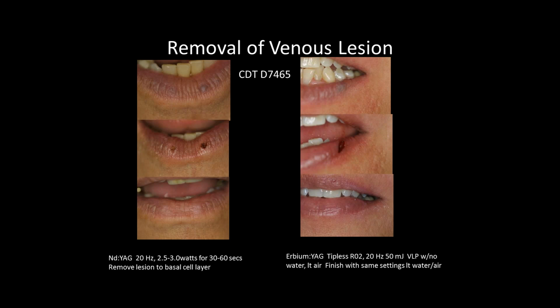Even the case on the left is actually a gentleman that just brought it to our attention. And I've been told by patients that they've talked to their dermatologist about these, and the dermatologist has told them that they'd have to go in and actually scalpel away or cut away part of their lip to do this, and actually talked them out of it.